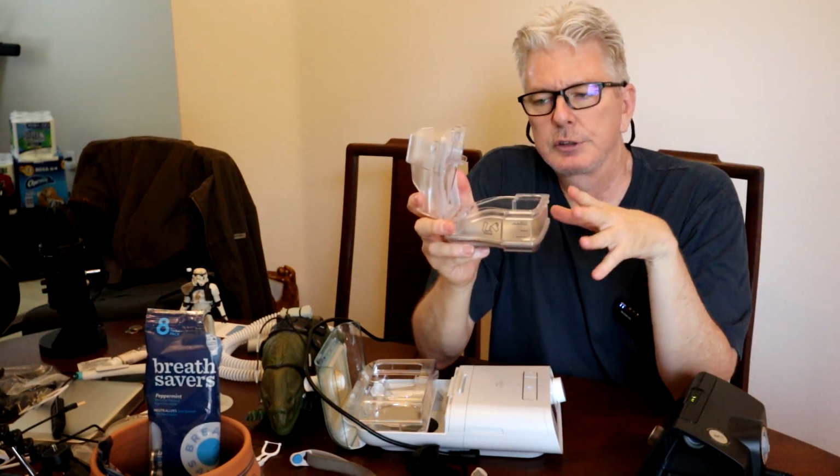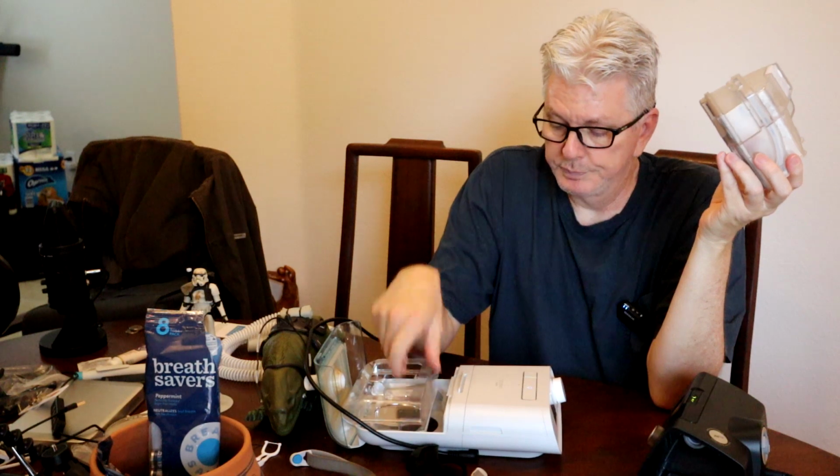You know how high to fill it every night when you go to bed. The ResMed water chamber, I don't like as much as this one. However, I will say I think the ResMed's a little sturdier because I haven't noticed any cracks in the water chamber on the ResMed. But again, I like the design a lot better on the Philips. That's just my personal preference.